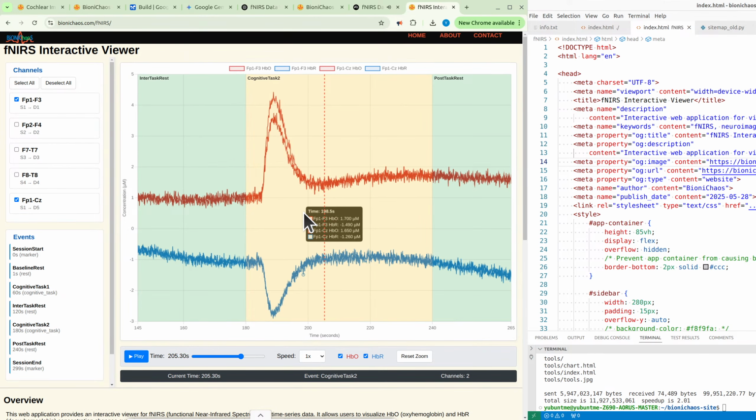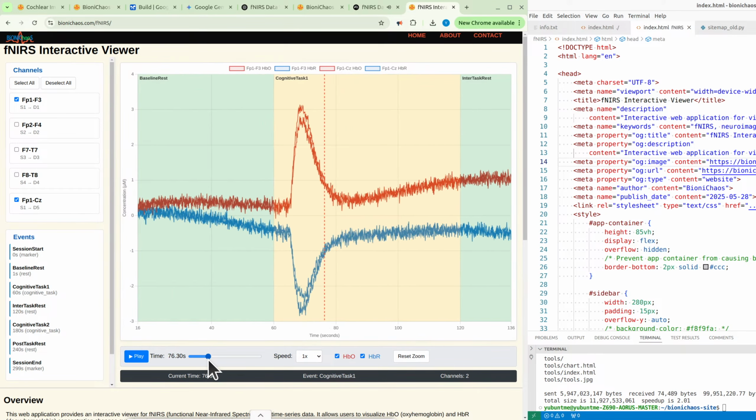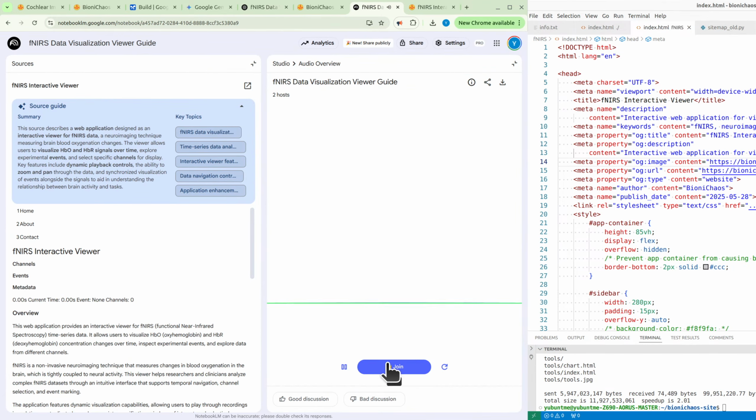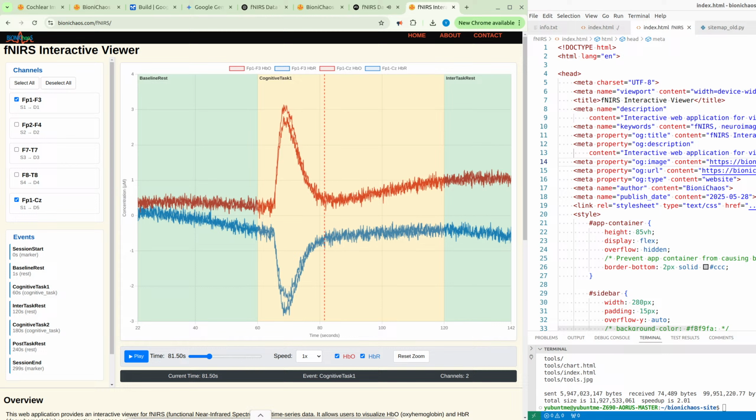And our mission here is sort of twofold. First, just quickly understand what this viewer shows. The basics, the lines, the task markers. Right. But then the real core of this deep dive: how realistic is the actual fNIRS data shown in these pictures? We're leaning on an expert critique here. Because it looks slick? Maybe a little too slick. That's the heart of it.